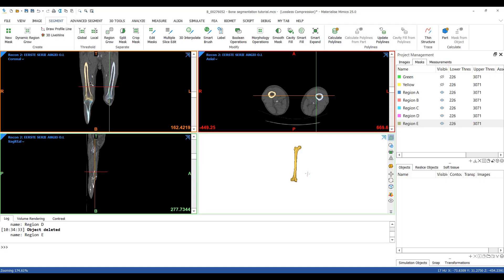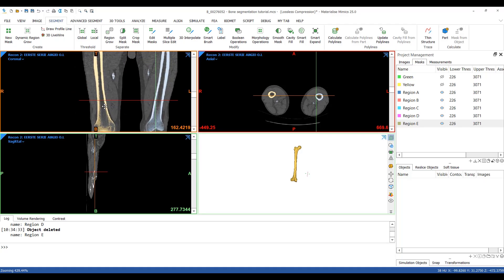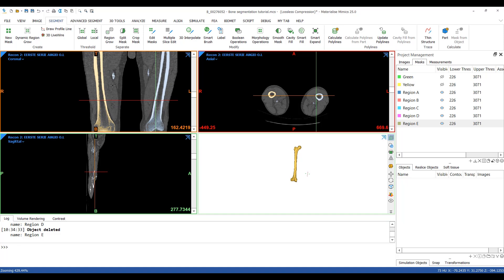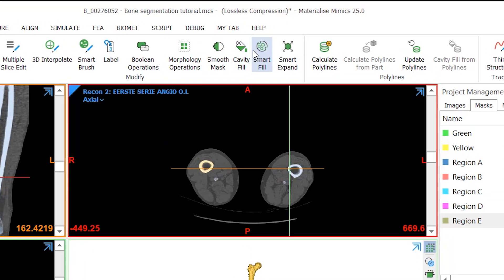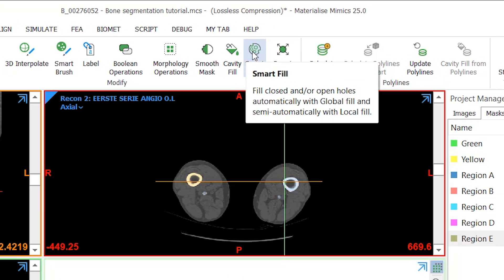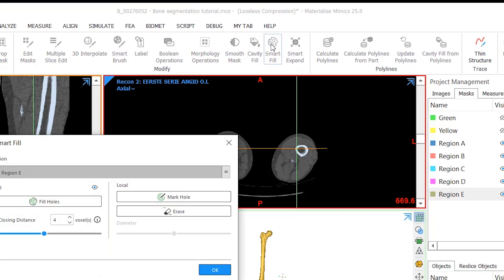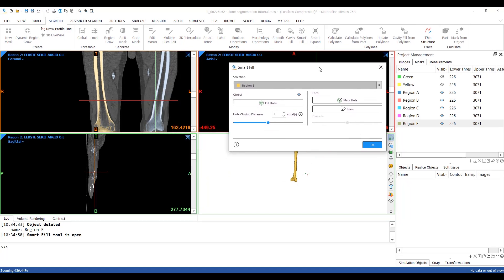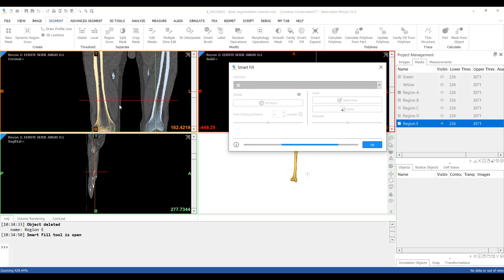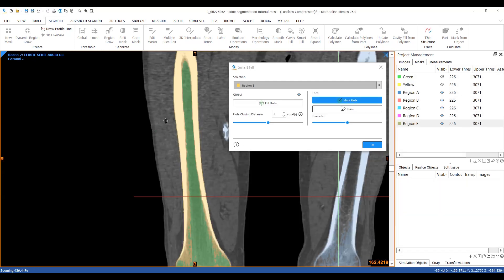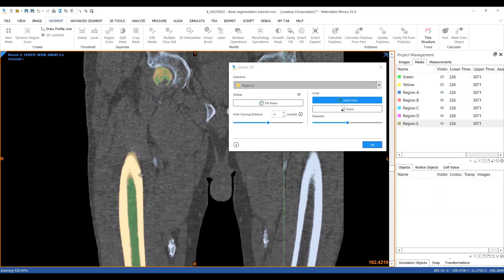As a final step I want to fill up the empty spaces in my femur to end up with a solid bone. I can do this with the smart fill tool in the segment tab. What I really like about this tool is that it gives me a preview of the adjustments before they actually happen. I'll first fill small holes automatically.